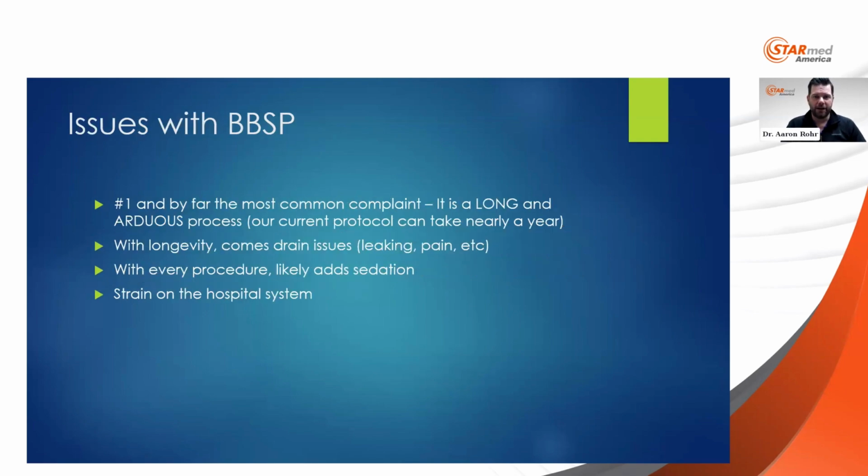So the big issue, and I know I'm speaking to the masses with this. The most common complaint from patients, by far, at least in our practice, is the duration. The one benign stricture protocol that we initiated, the one that we tailored and changed, is very long, very arduous. It can take nearly a year of simply placing a drain, upsizing over time, whether or not you use balloons or whatever technique you wish to expand or open that stricture. All of them take time, at least in our experience.